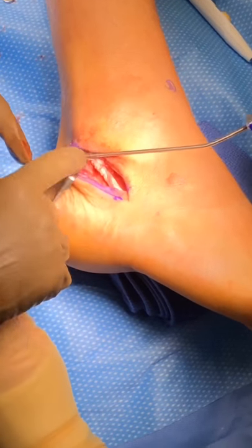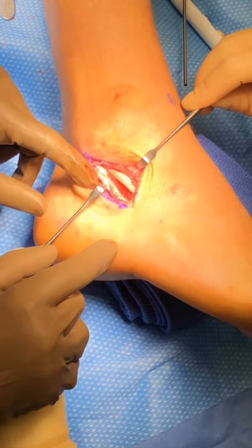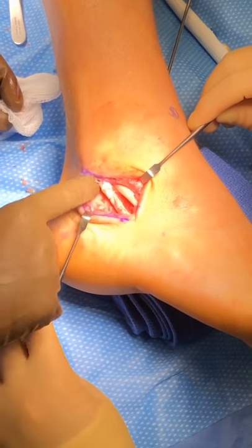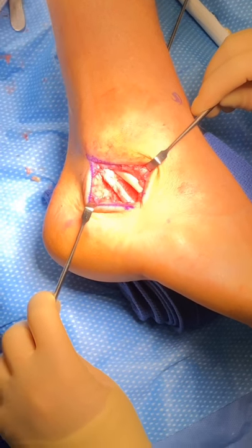Now we'll just clean up some of this residual inflammatory tissue and clean up the skin, and then typically we'll keep them non-weight bearing for 3 weeks and then let them walk in a boot for 3 weeks and then get them into a brace and some physical therapy and increase activity from there.